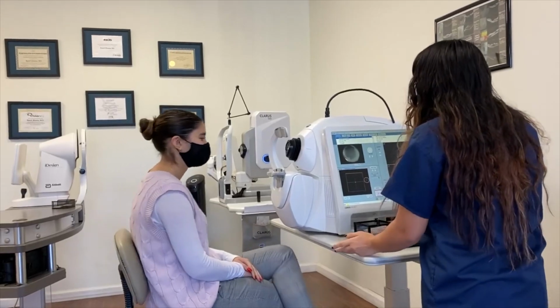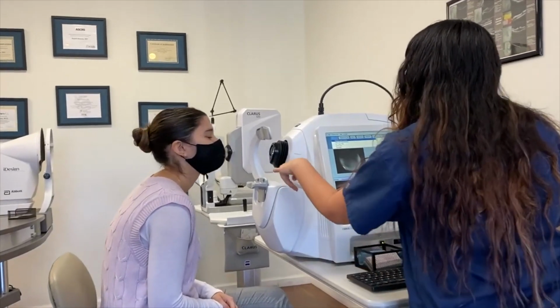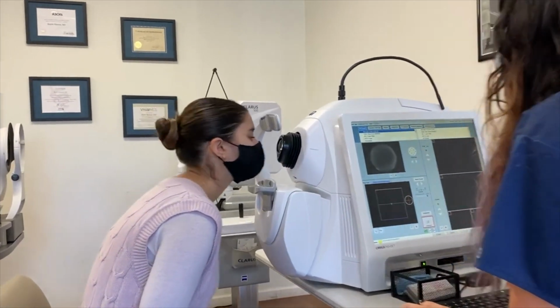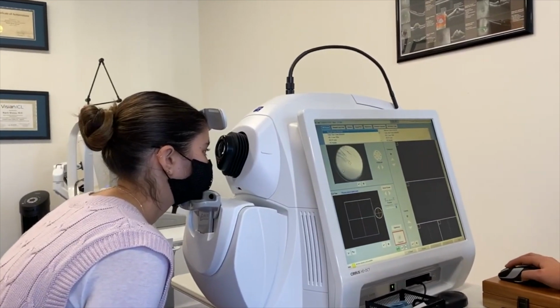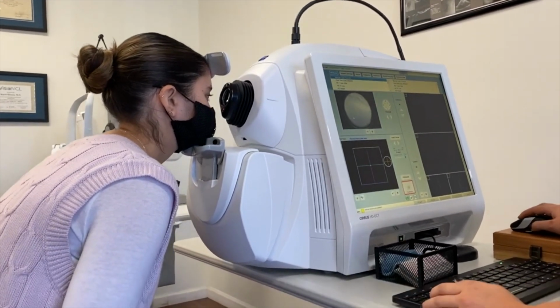So each laser is unique, just like your eye, and the nomograms are built around each laser and they're fine-tuned. We will also make sure that the rest of your eye, that there's no macular degeneration, no glaucoma, no advanced dryness, and if anything we find, then we discuss with you. And if dryness is there, which is very relevant and common in Southern California and hot areas like that, we start dry eye treatment. Of course, there's consents where we'll discuss everything in detail, so you don't have to Google anything or talk to your cousin's uncle somewhere.